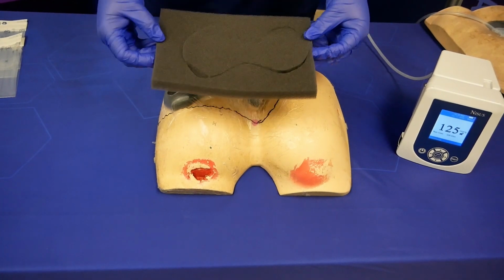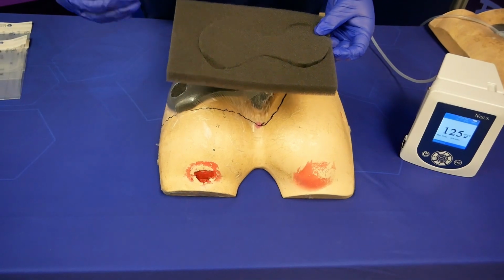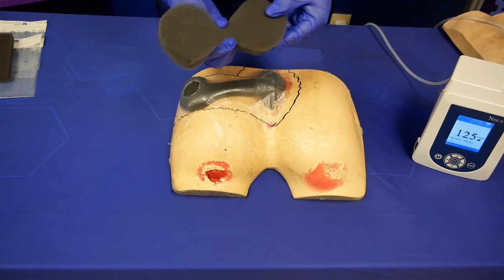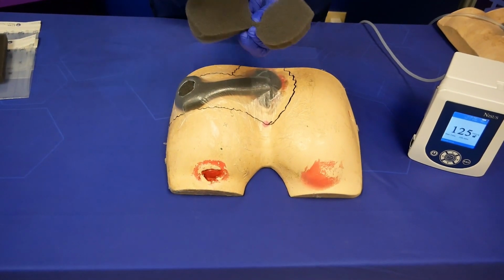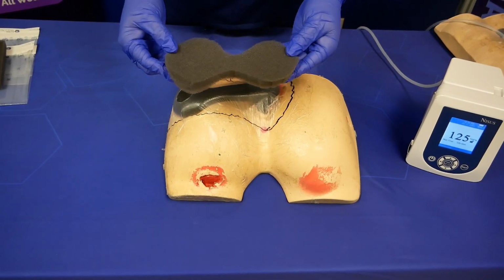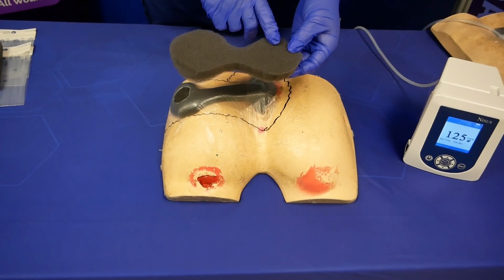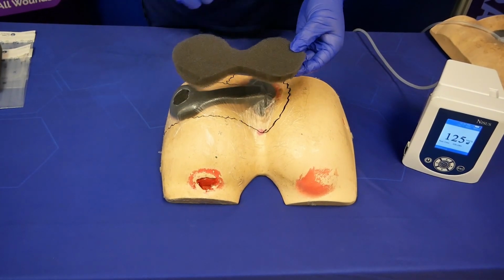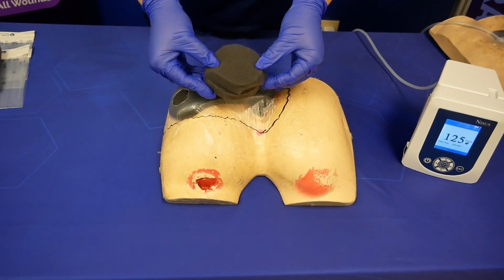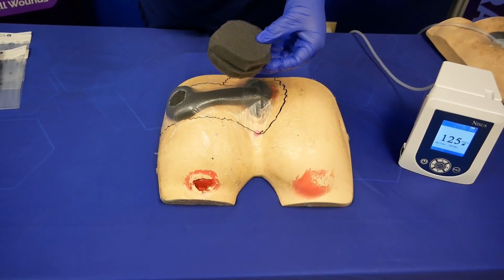If you have a deep wound and you need to double stack your foams, you can certainly do that. I've got another pre-cut piece here. Now you could have these two individual pieces and stack one on top of the other, but you can also do a clamshell method. So what I like doing is cutting the shape that I need at the bottom of my foam, and then a mirror image of that above it, so then I can close it in on itself and insert it into the wound. So I will now have a double stack using one piece of foam.